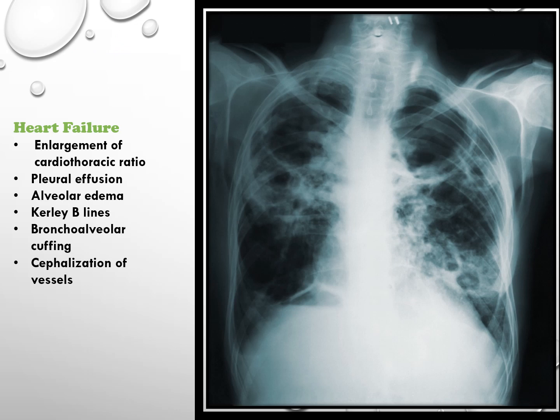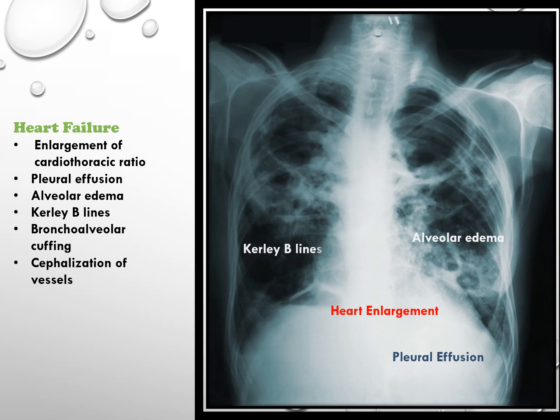This x-ray exhibits features indicative of heart failure. There is enlargement of the cardiothoracic ratio, which is more than 50% of overall diameter. Blunting of the costophrenic angle shows pleural effusion. Alveolar edema and Kerley B lines represent increased fluid in the pulmonary interstitium.